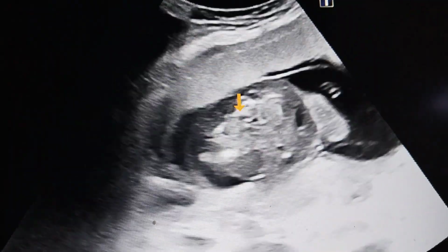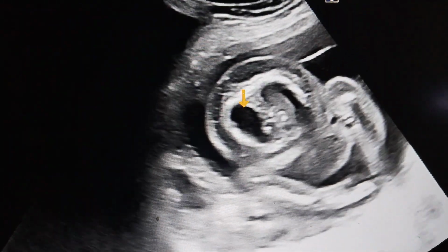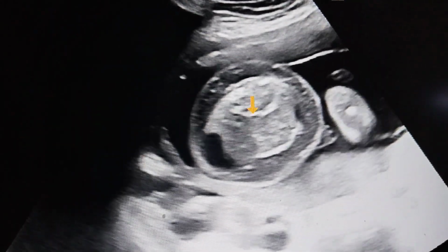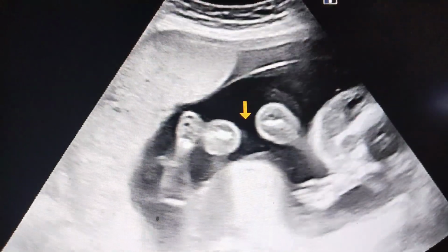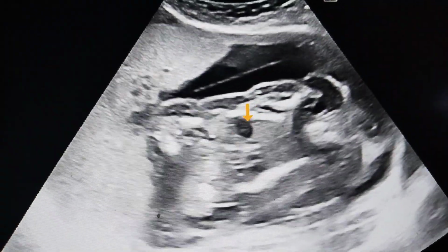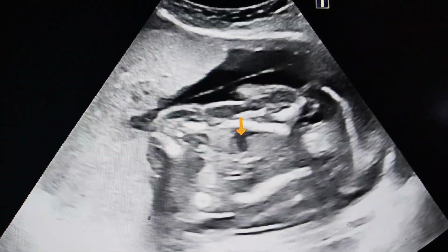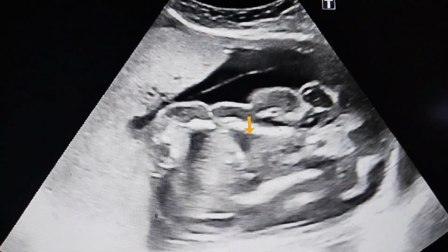the fetal heart and lungs. So this is the fetal lungs. So this is the fetal lung, which is floating within the fluid. This is the pleural effusion.